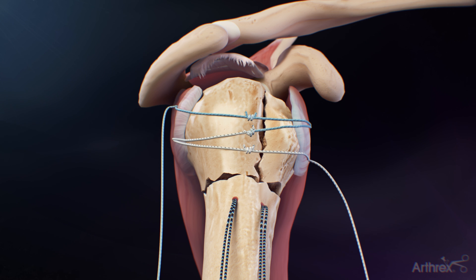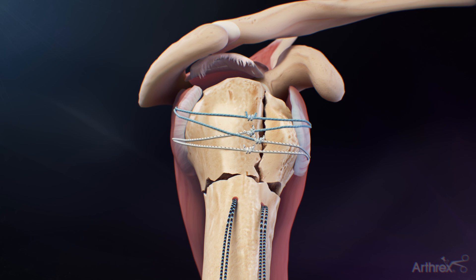Take the remaining white-black tiger tape from the lesser tuberosity and the remaining blue fiber tape from the greater tuberosity and tie them together. After the suture construct has been tied, pass and tie the vertical tension band sutures.